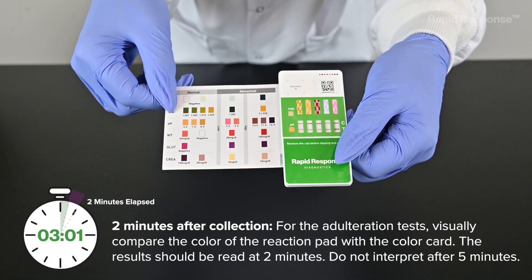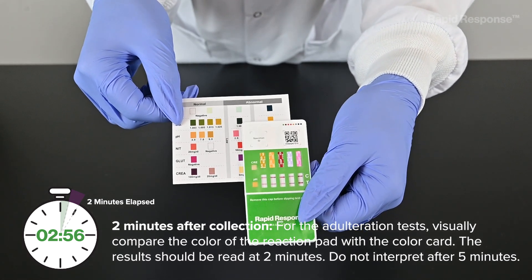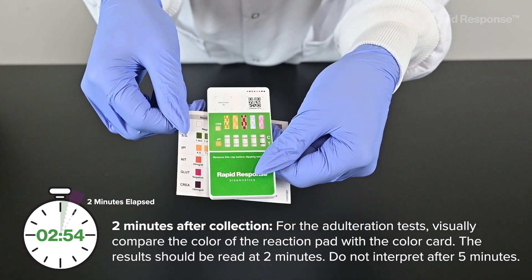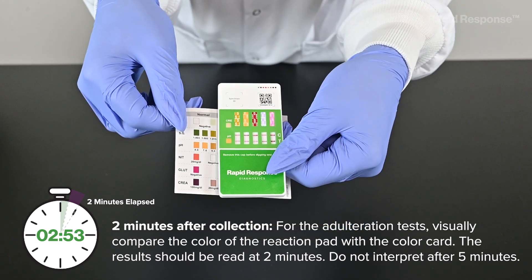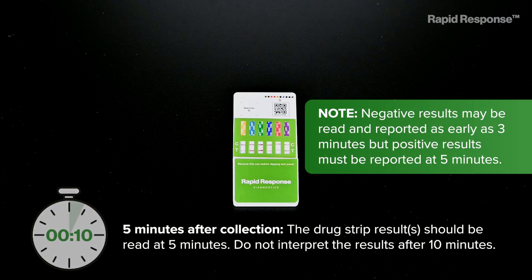At 2 minutes after collection, for the adulteration tests, visually compare the color of the reaction pad with the color card. The results should be read at 2 minutes. Do not interpret after 5 minutes. At 5 minutes after collection, the drug strip results should be read. Do not interpret the results after 10 minutes.